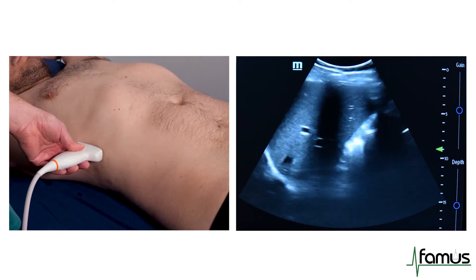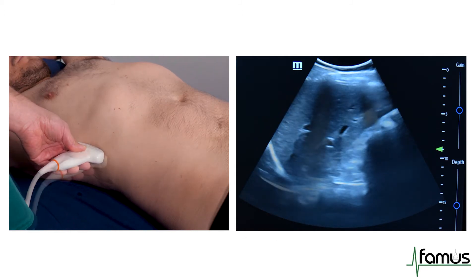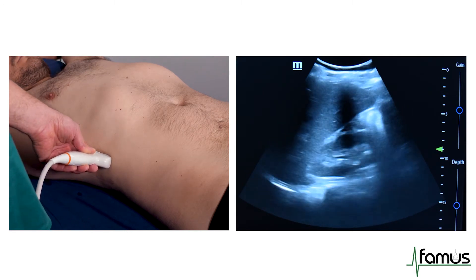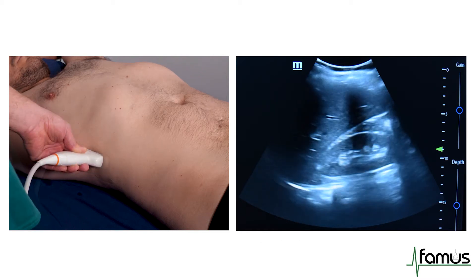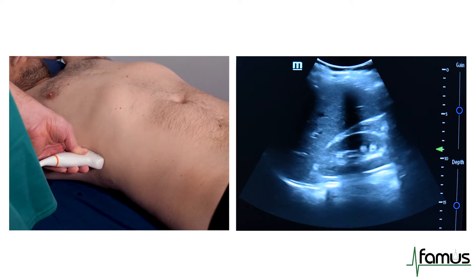What we can see is our liver. I will then tilt my probe posteriorly to get the kidney into view. I will check at this view for intra-abdominal fluid in Morrison's pouch.